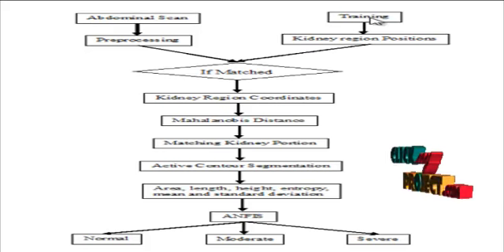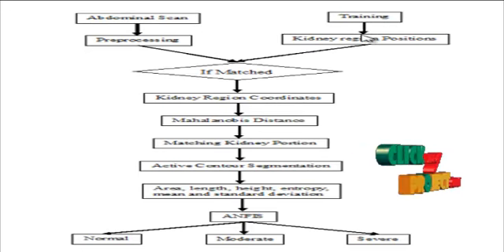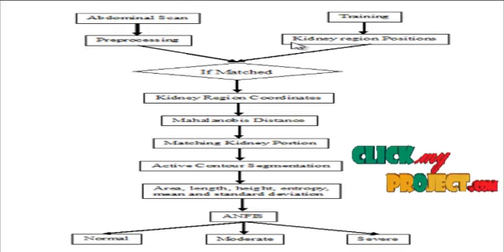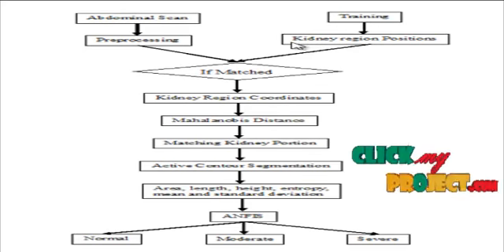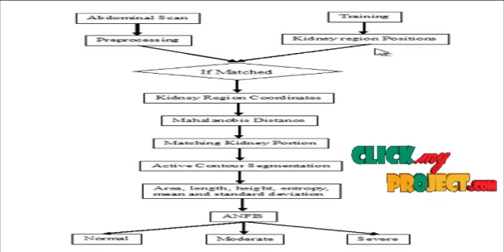So once we have trained the database and the registered portions were saved, we calculate the distance between the extracted mean values, and based on that the image with the minimum value is the matching one. That is, we have calculated the mean value for all the images in the dataset and saved it previously.